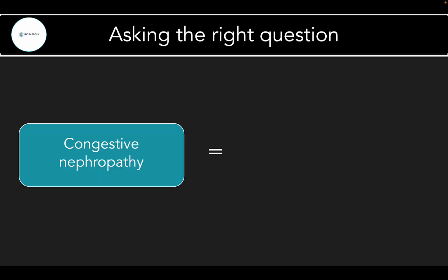And lastly, the hemodynamic AKI, and in particular, congestive nephropathy. So as with fluid tolerance, an elevated CVP, so a plethoric IVC, is a useful first step and is a prerequisite for clinically significant organ congestion. So a plethoric IVC cannot make this diagnosis alone, however, it's not specific enough for that, but it's highly sensitive, so it's a good place to start for this.